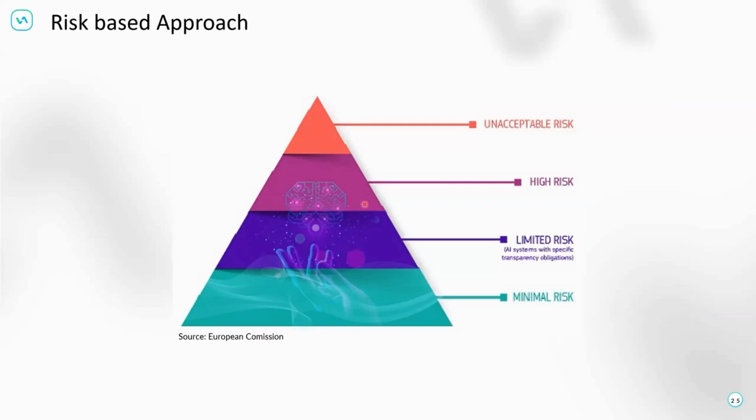Okay, so as said previously, the correlation between the medical device classification and the AI classification is not direct, so it can be done in different setups, and it can be medical device low risk, whilst we have AI Act high risk. That can lead to conflicts in your declaration. However, the regulations will be very precise, and that's what you need to cover. You need to look at the regulation first to cover them in the correct way.